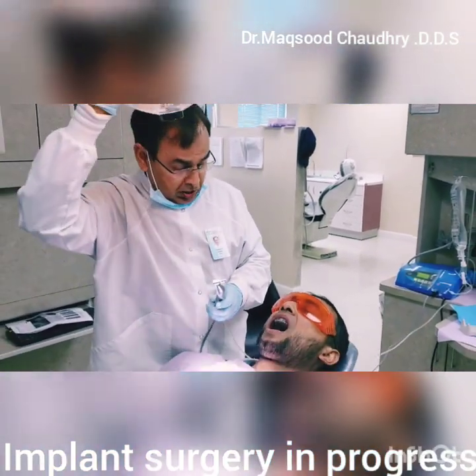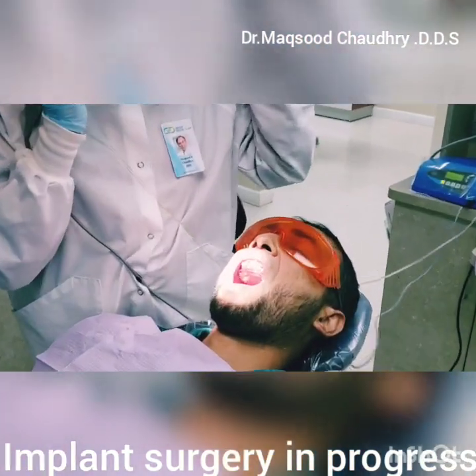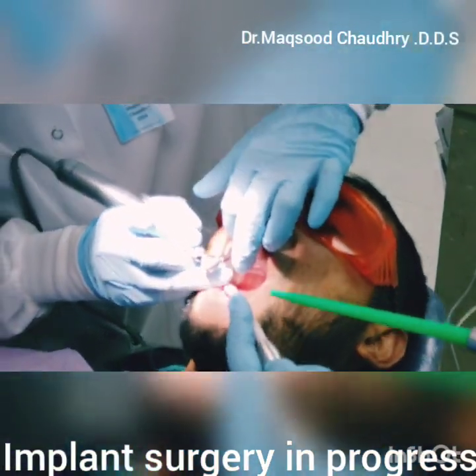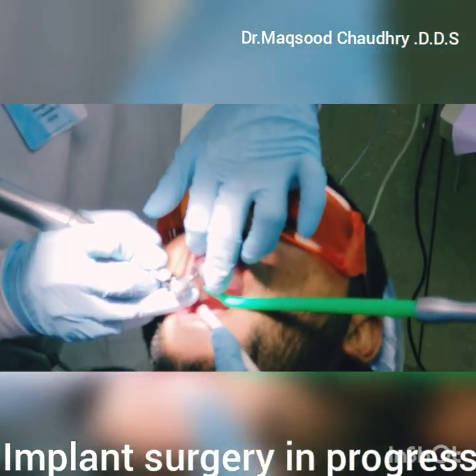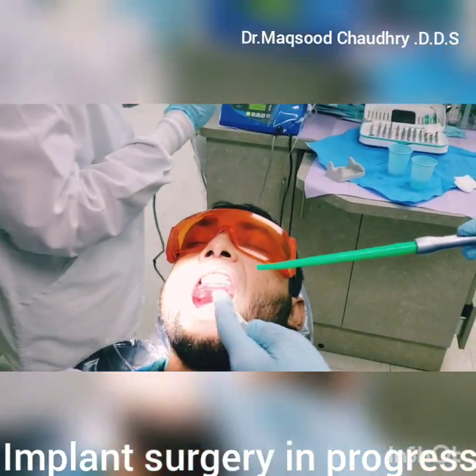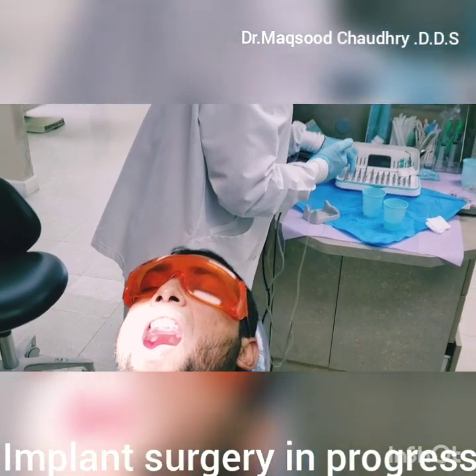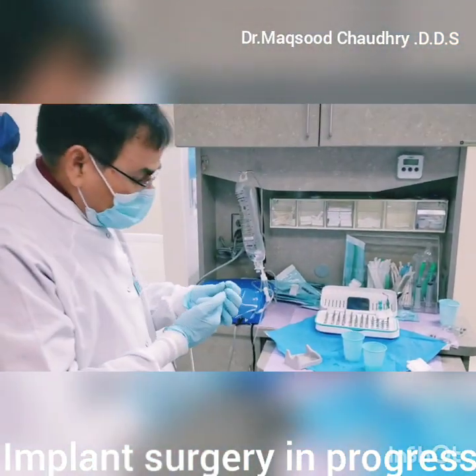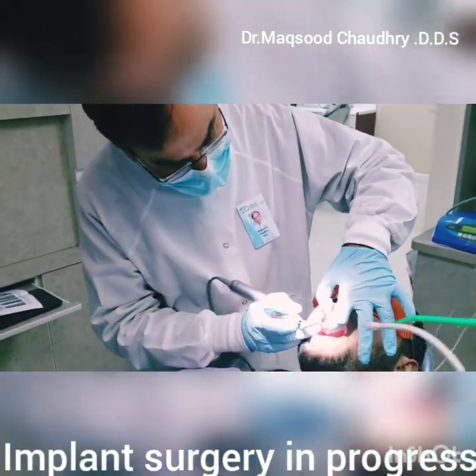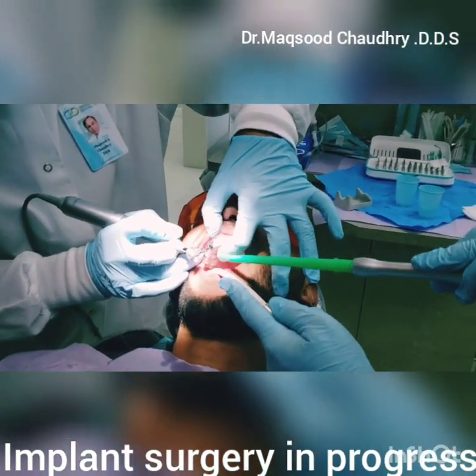And after the tissue punch is done, then we are going to do the next step, which is a surgical drill, which is necessary for the appropriate size. Right now we are putting a 4 mm by 11.5 mm implant, so this is a 1.5 mm drill.